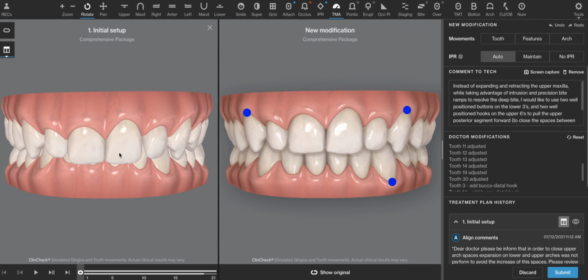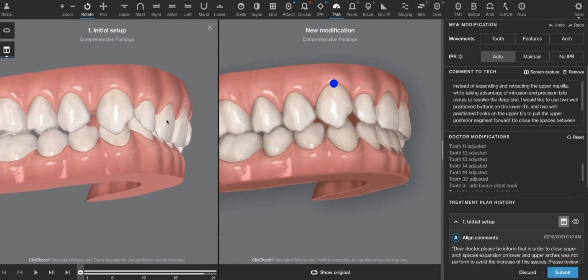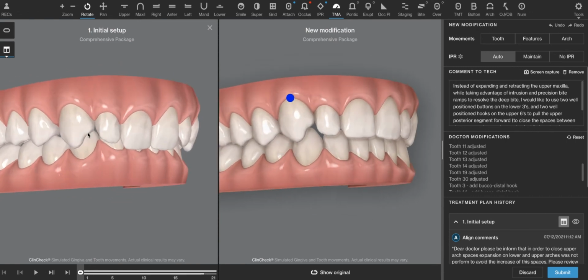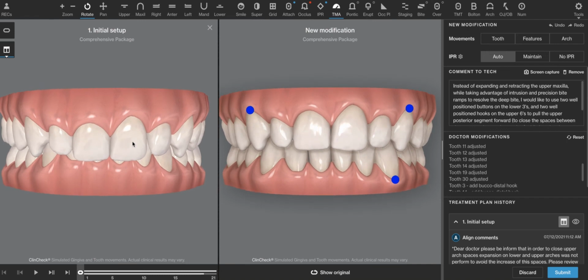So, I'm not trying to overcomplicate this, but these are the things we need to think about in order to avoid patients' expectations not being met. As with any situation, it's always better to think first rather than explain to the patient after something happens.